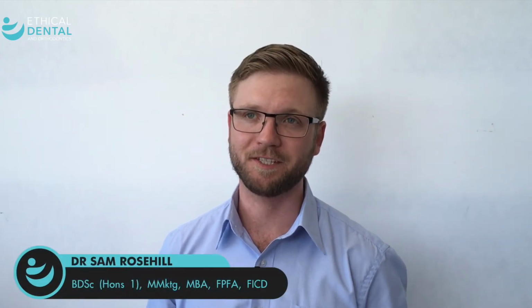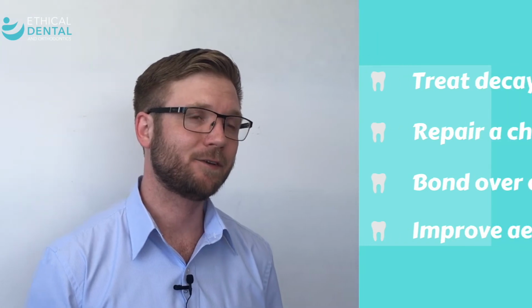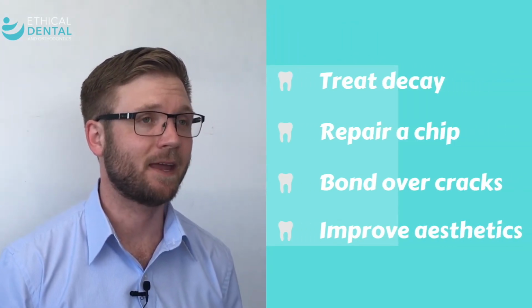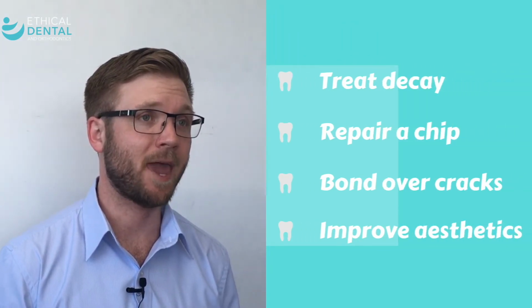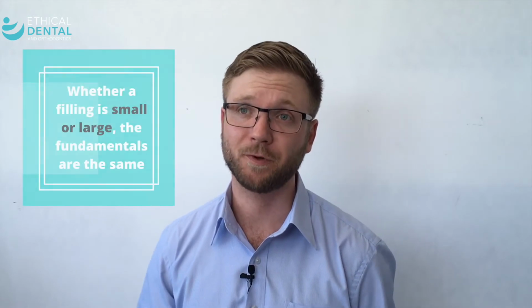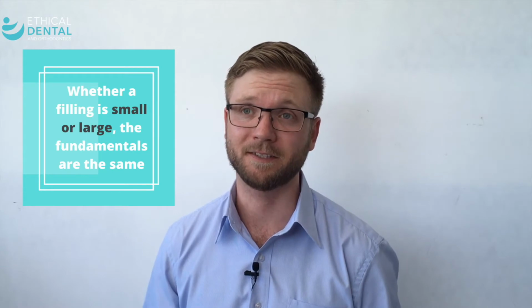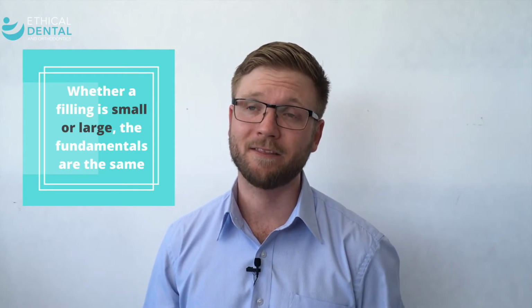Having a filling is one of the most common dental procedures, and most of us at some time or another in our lives will have to have one. Fillings are mainly used to treat decay, but they can also be used to repair a chip or a crack, or even for aesthetics. And they can range from a very small and superficial reconstruction to a full tooth rebuild in some cases. But generally, no matter the size, the steps are usually the same.